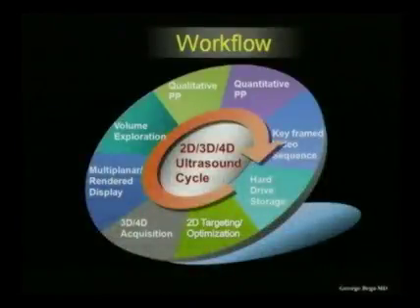So a normal workflow when we use 3D ultrasound is pretty much this one. We start with 2D ultrasound. We go over the area of interest. We typically, over the years, know what are some of the best acquisition planes to acquire a volume. So we target and optimize our image plane to those standard planes. Then we drop a volume box, which is the same box similar to a color or power Doppler box. We adjust width and height, and we adjust the depth.